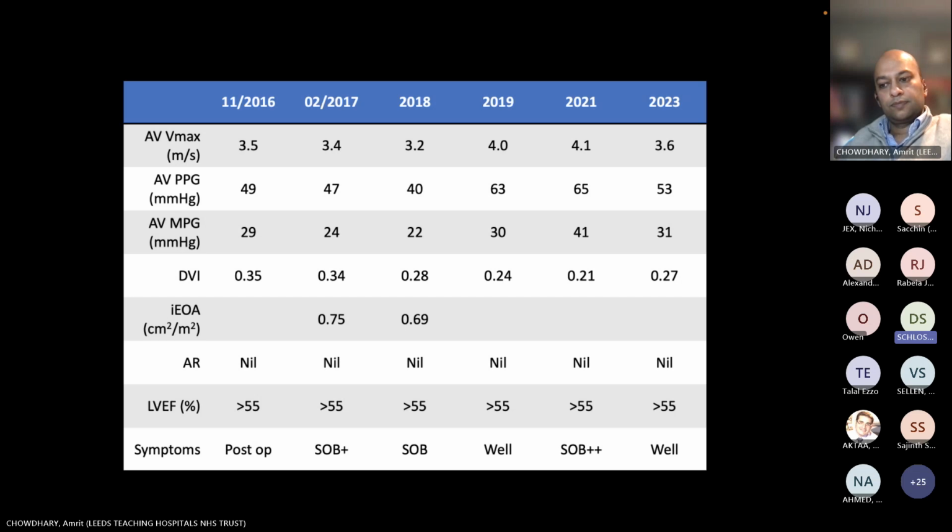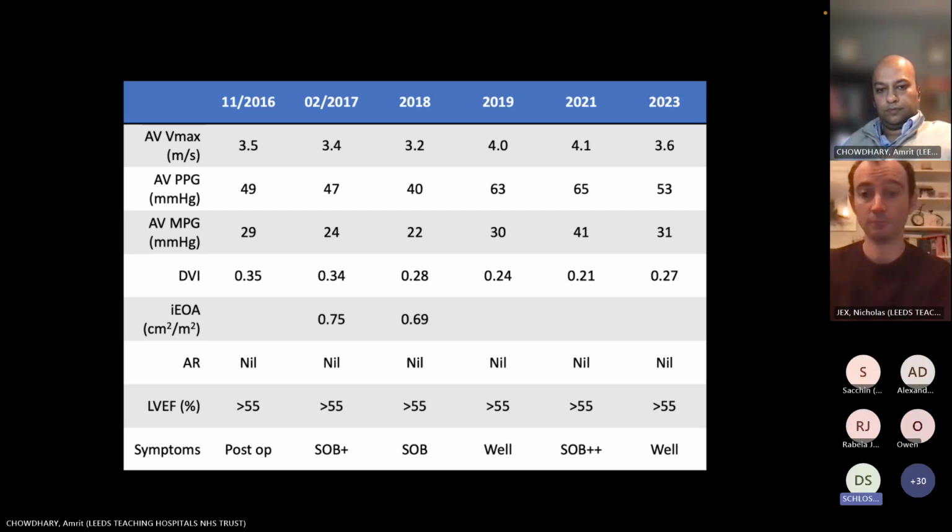But it is important. And again, just to remind people, if you have a high gradient across the aortic valve or any valve, it's usually one of four options. It's either too small a valve. Look at the baseline echo. It could be an obstruction. That's usually an increase compared to the baseline echo, and the motion is different. The motion of the leaflets is incorrect. Or everything's fine: the valve is big enough, and you can have regurgitation, or you can have a hyperdynamic heart. So one of those four, usually.